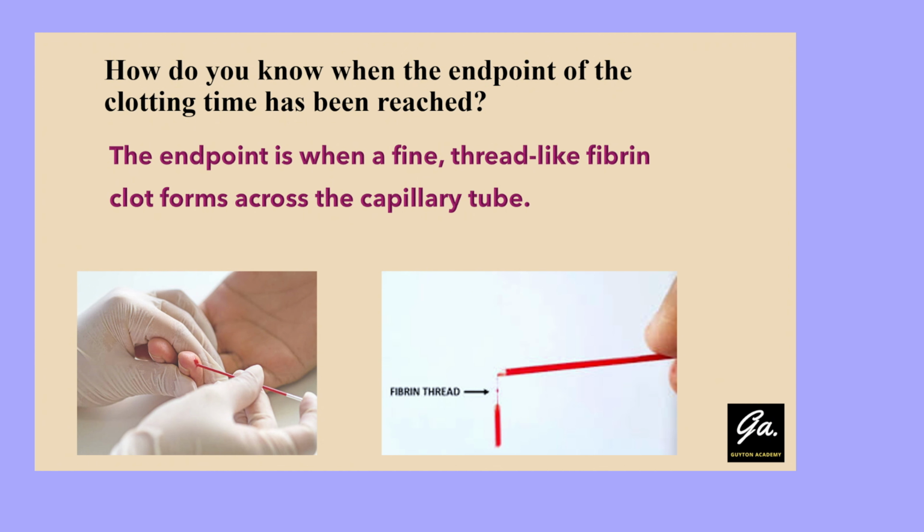The end point is when a fine thread-like fibrin clot forms across the capillary tube. This is a fiber-like structure. So this is the end point when we have to stop the stopwatch and note the time.